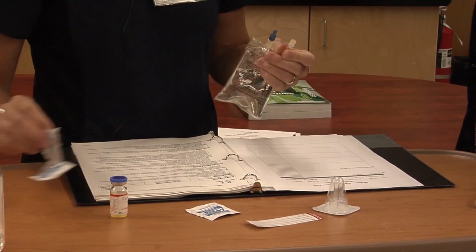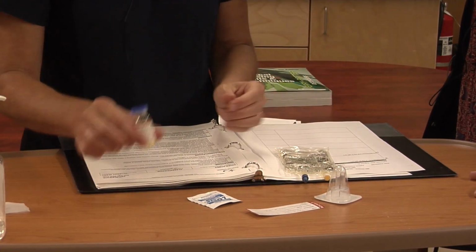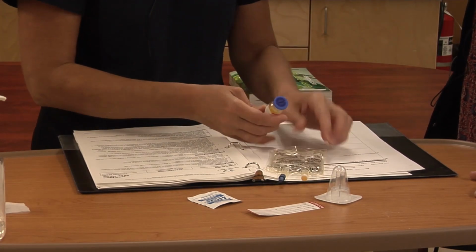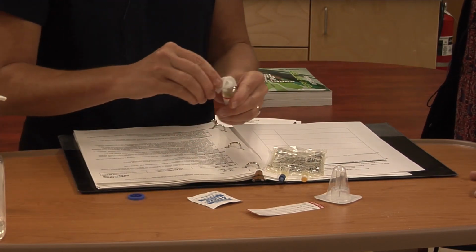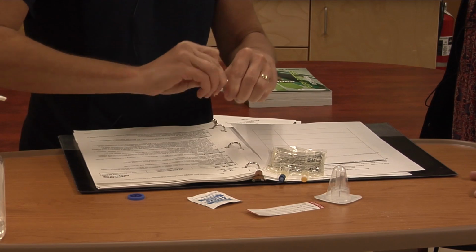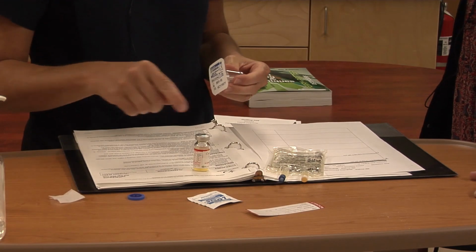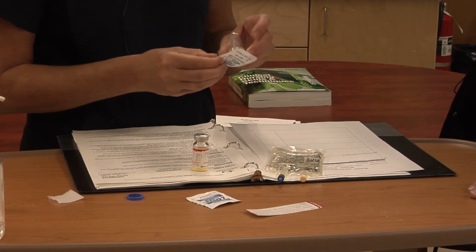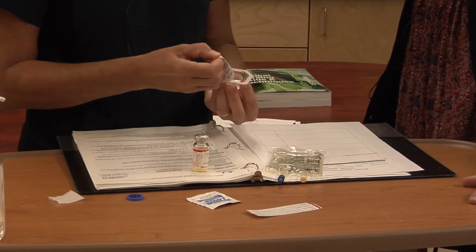Okay. So 15 to 30 seconds, let it dry, and just set that in a way that it's not going to become contaminated. Again, check your drug against your MAR, drug, dose, patient, time. Flip the lid off, and actually the manufacturer wants us to clean these lids too. So another 15 to 30 seconds. Okay, and our time has lapsed and this has all dried. These reconstitution devices are pretty nifty. Especially how you get into them, eh? Yeah. There we go. All right.